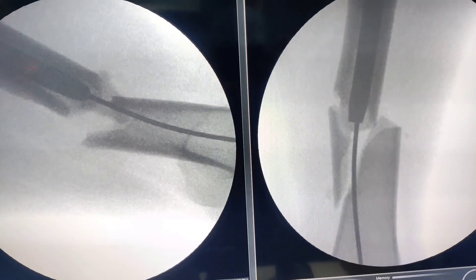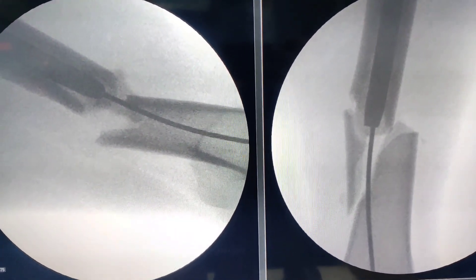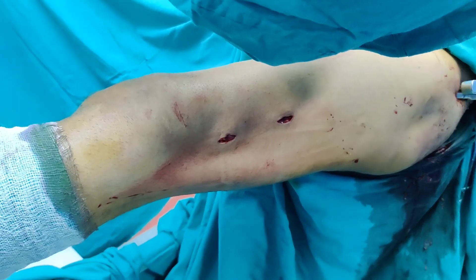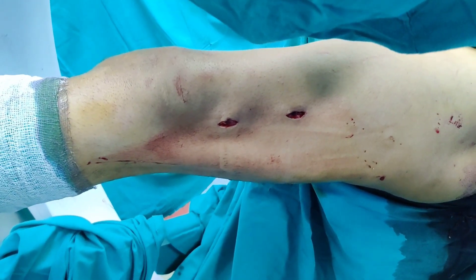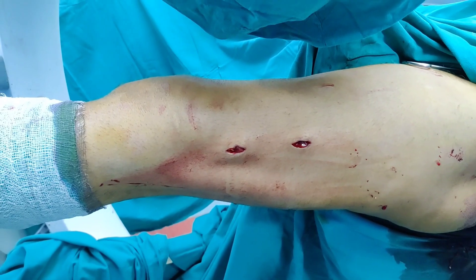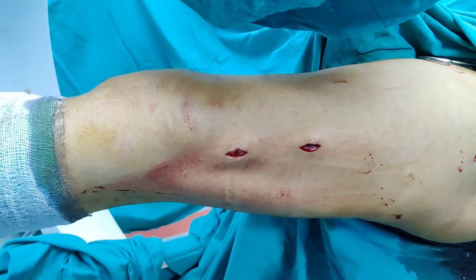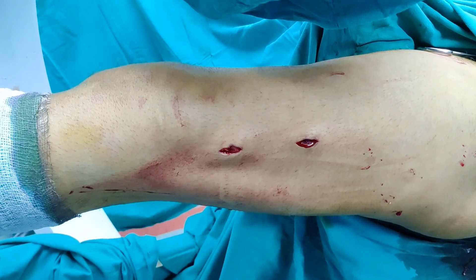You have to open it, but those incisions are very small and you do not have to disturb the fracture hematoma. We have made two small stab holes — one is in the distal fragment and one is in the proximal fragment. When the fracture is this distal, it becomes very difficult to control it with manual forces.